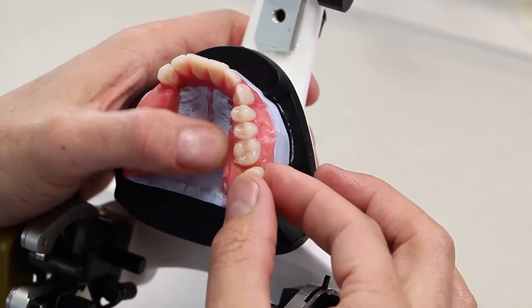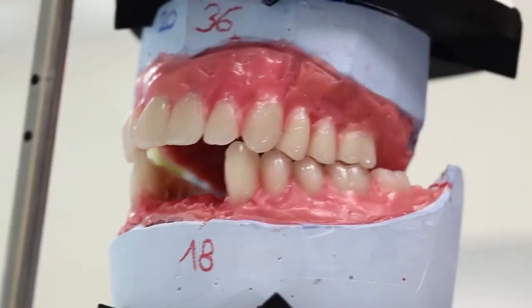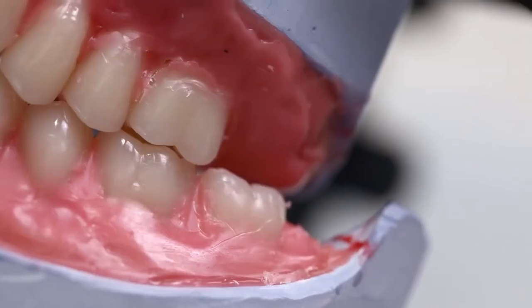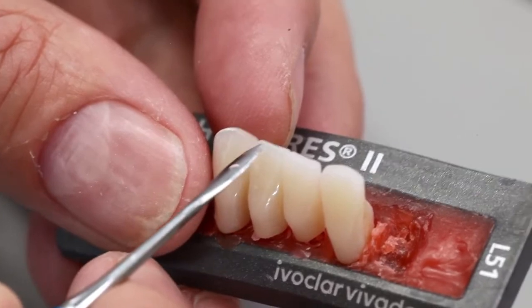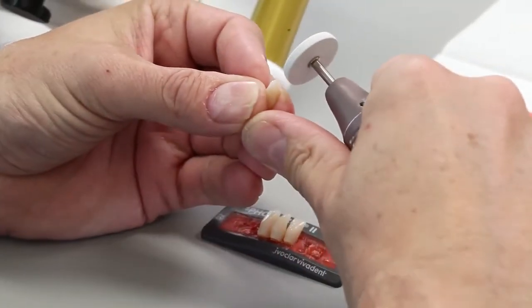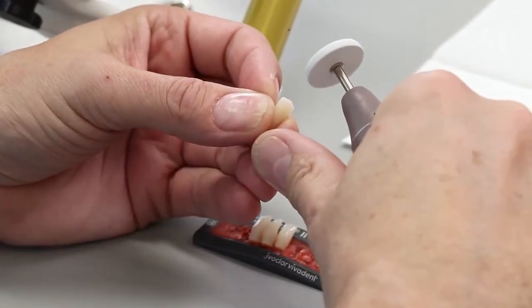If there is not enough space or for reasons of statics, the maxillary second molar can be omitted. If space conditions permit it, set up the second molar in the mandible to support the cheeks. As far as the mandibular anterior teeth are concerned, in most cases, only the incisal edges can be seen in the top view. In order to achieve an aesthetic appearance, interlock the anterior teeth and grind in wear facets.